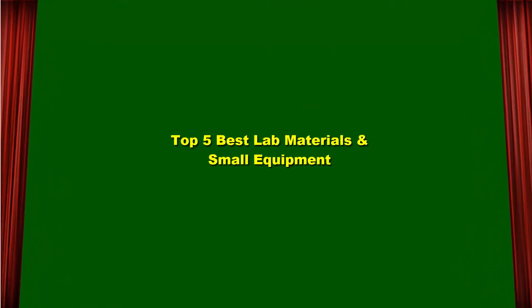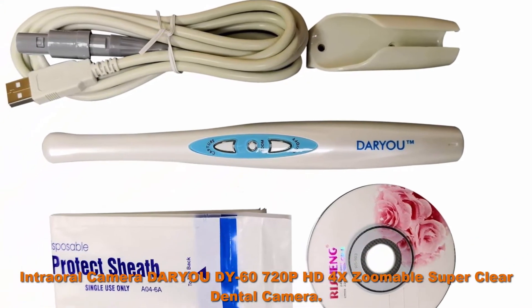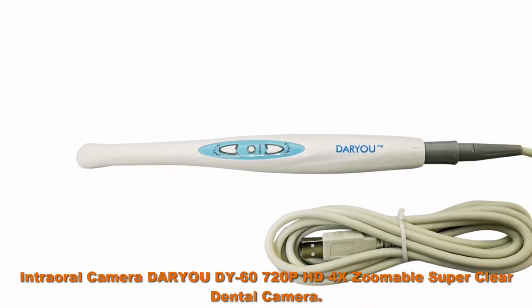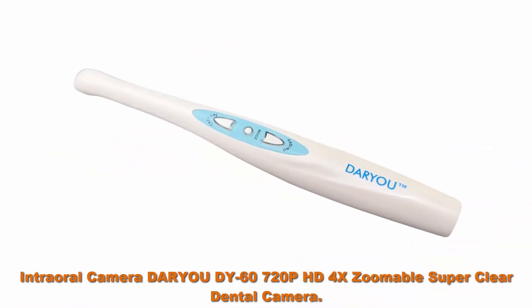Top 5 Best Lab Materials and Small Equipment. Top 1: Intraoral Camera DARYOU DY-60, 720p HD 4X Zoomable Super Clear Dental Camera, USB compatible.